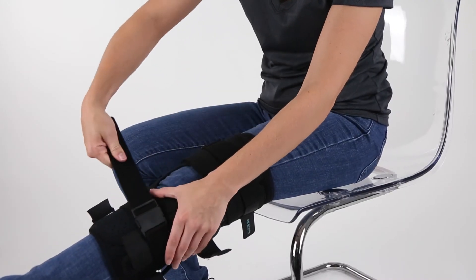This brace integrates easy clip-on buckles and trimmable velcro straps for the perfect fit, to help users progress through injury recovery or post-surgery rehabilitation.